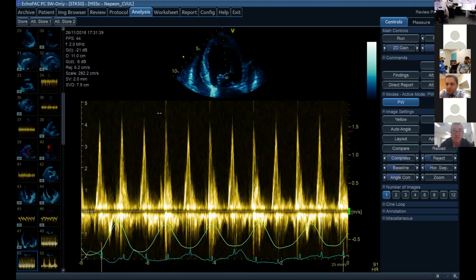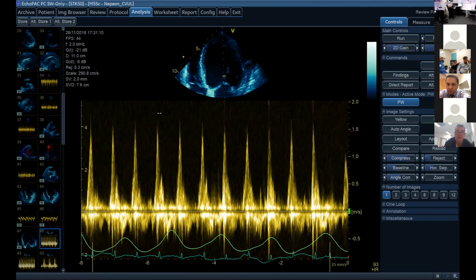You can see that the patient's quite tachypneic, because her heart rate's 90 and her respiratory rate is like every 3 cardiac cycles. In the exam, what the examiners really like, this being an exam for clinicians, is this: if the question is how do you use echo to diagnose tamponade, it's not unreasonable to say it's a clinical diagnosis backed up by echo. Sometimes it's really hard because patients are really short of breath, they often have different pathologies going on at the same time, and often you've got to drain the effusion and see how they go.